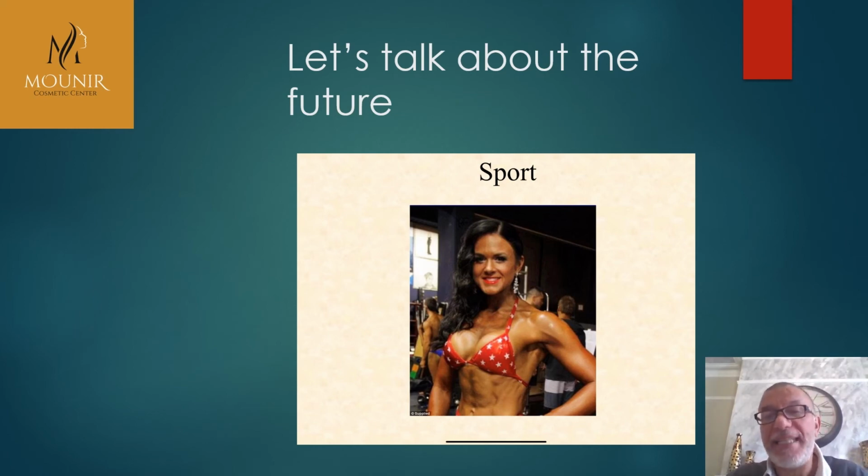So if you have a lady like this one here in the photo, she is a bodybuilder, and because of the fat burning, she has only skin. So you need to discuss with her what you're going to do and what kind of implant. And you need to discuss with her which profile of the implant you're going to go for.